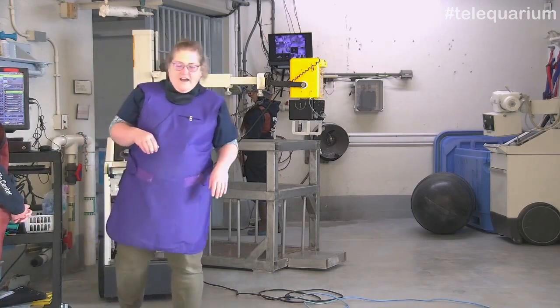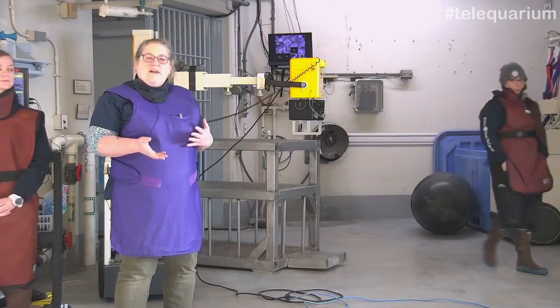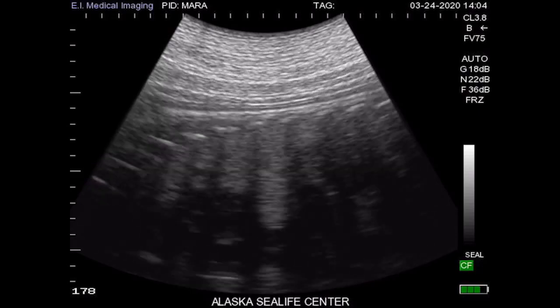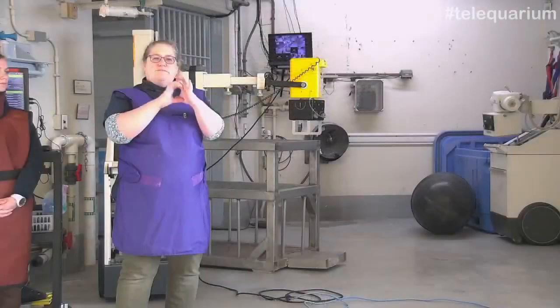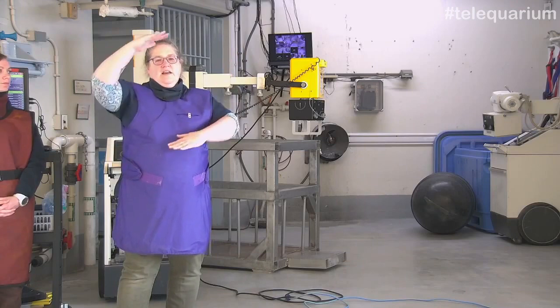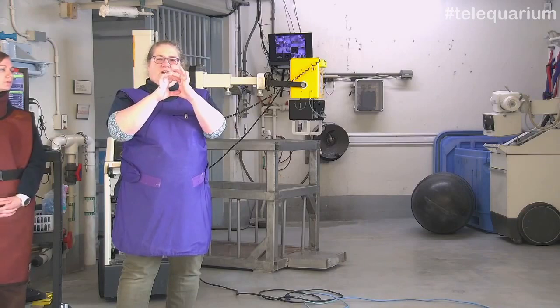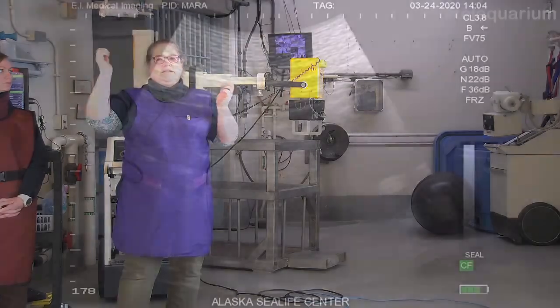So we have been monitoring Mara with ultrasound since December, and we've been seeing heart rate, we've been seeing some bone structure, but with ultrasound, we only see about this much, if we're lucky. That's one of the reasons we're taking an x-ray today, because the baby's bones hopefully are now calcified enough that we can see bones and get an idea of how old the baby's gonna be, and thus give us an idea when it might be born. But also we're gonna get a picture, essentially the size of the x-ray plate versus our teeny little bit of ultrasound, which we use to monitor heart and stuff, but we can't get an idea of how big the baby is.